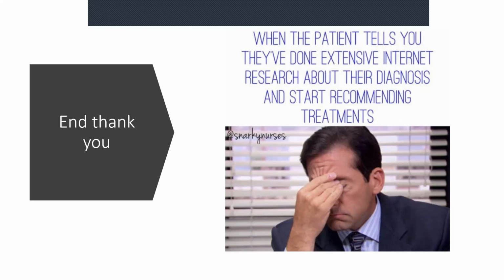So do you understand how you have to start analyzing an ECG? All right. Now I know today there were still some blank faces, so I'll give you guys a chance again. Go and watch those videos, just on the basics. And next week, we're still going to have a look at a relatively basic ECG, but you can see how much depth you can get even from a basic ECG when you really look at it. Still another week, so cancel one night of Netflix, sit and watch those things, so that when we come back next week, at least you guys will have a bit of a clearer idea of what we're talking about. I don't want you guys to get lost.